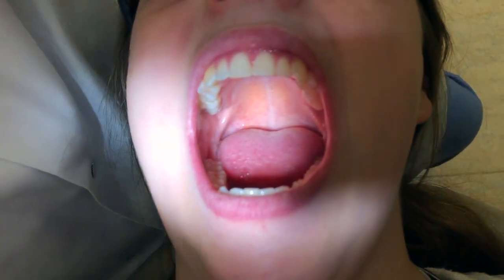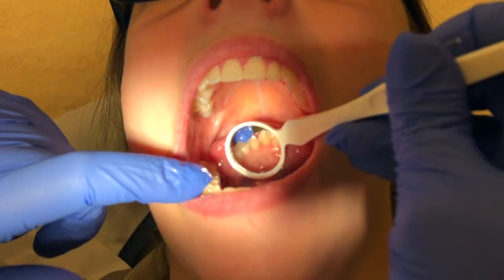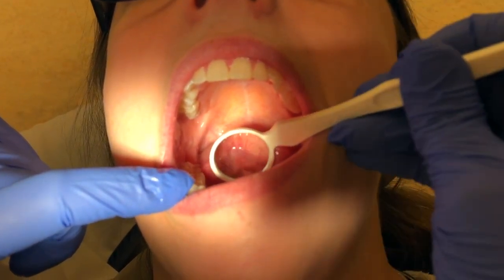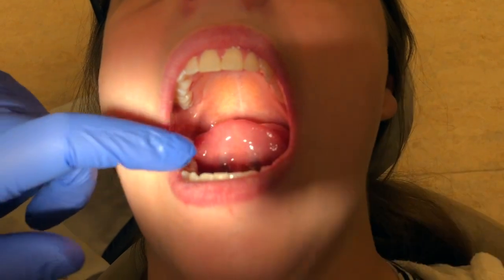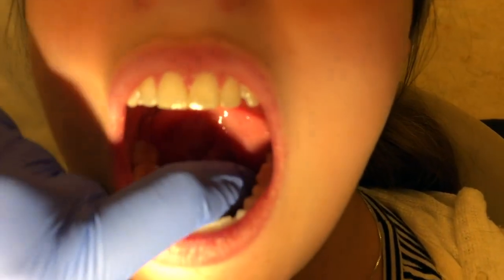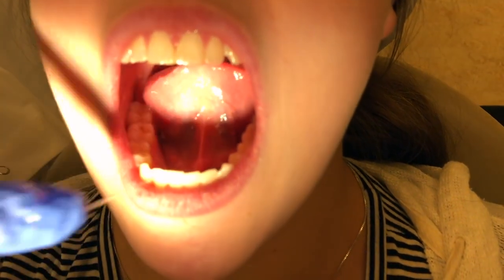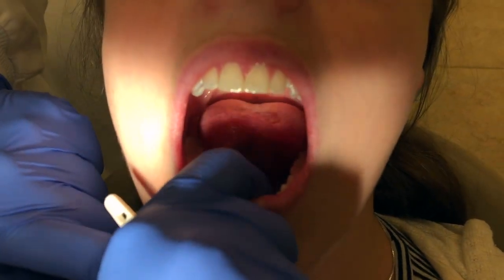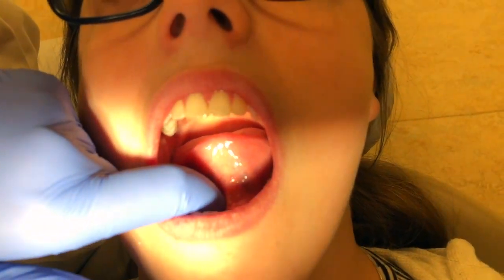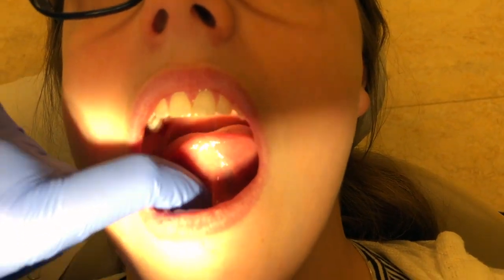Visually inspect the floor of the mouth. Use the mirror to retract the tongue to reveal the floor of the mouth. Manually palpate the floor of the mouth. Use your index finger, opposite hand to gently compress the floor of the mouth. Compress with one finger intraorally and support the tissue gently with the other hand.